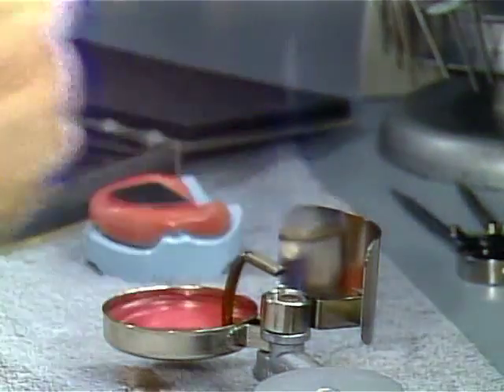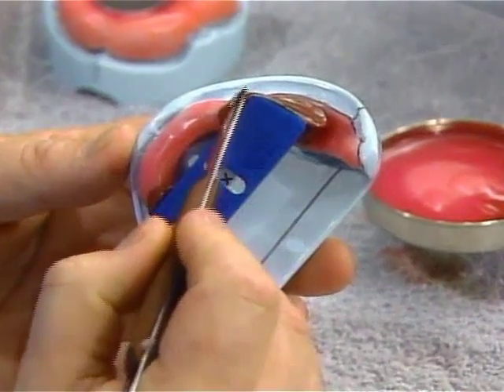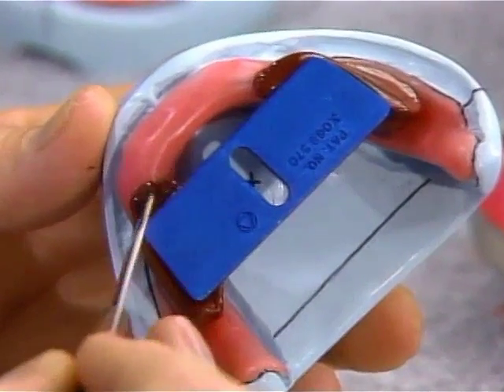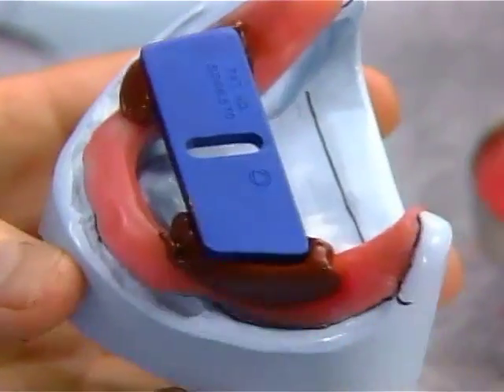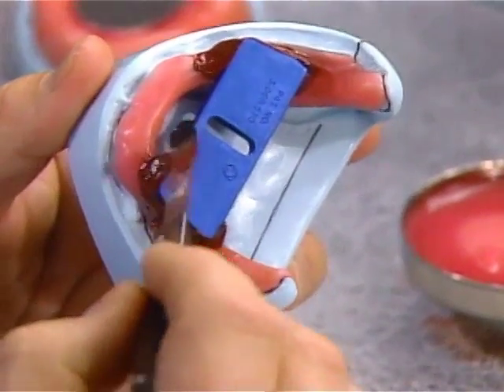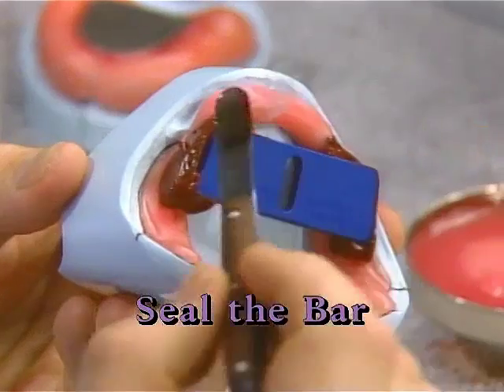With a hot wax knife, cut off excess compound around the bar on the labial. Cut at an angle sloping away from the bar on all sides. Seal the bar to the compound thoroughly on the labial. Make sure there are no undercuts under the bar.